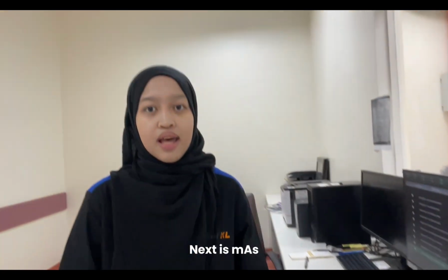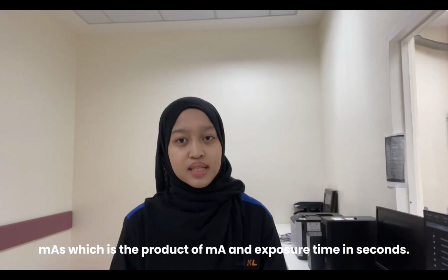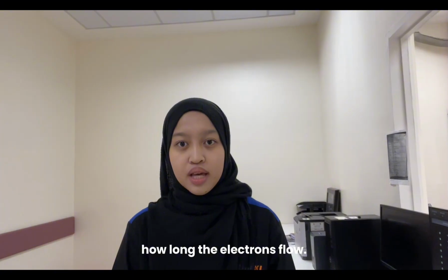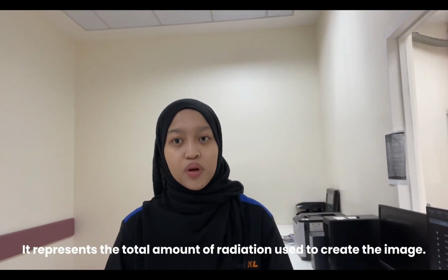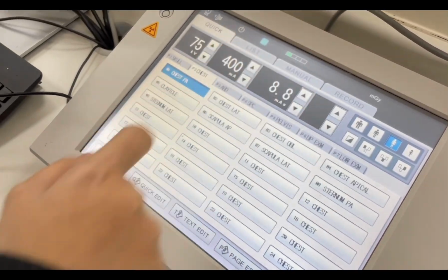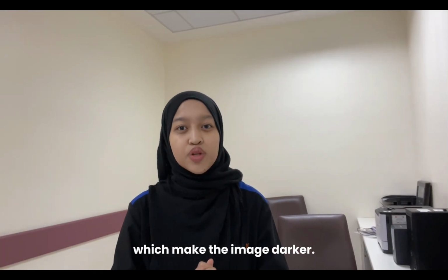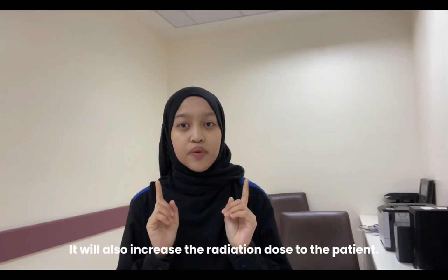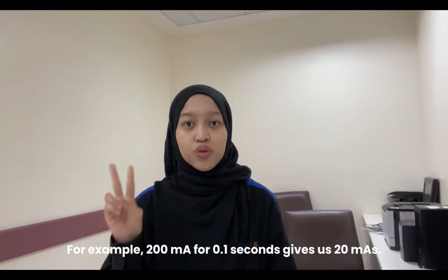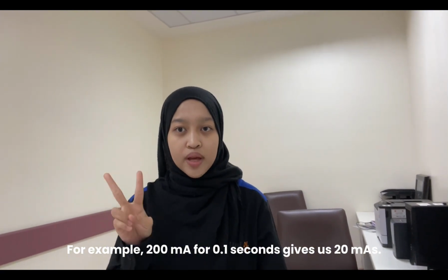Next is mAs. mAs is the product of mA and exposure time in seconds. It means that it controls how long the electrons flow. It represents the total amount of radiation used to create the image. Increasing mAs will increase the image density, which makes the image darker. It will also increase the radiation dose to the patient. For example, 200 mA for 0.1 seconds gives us 20 mAs.